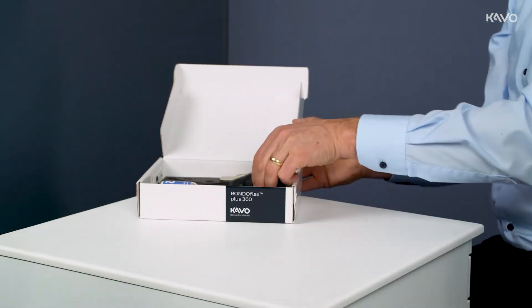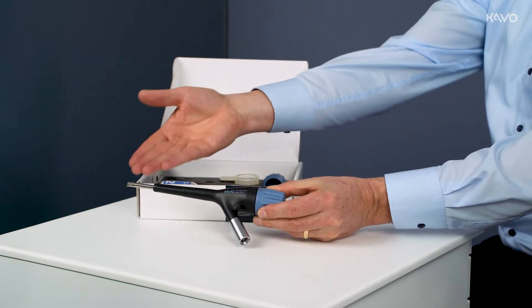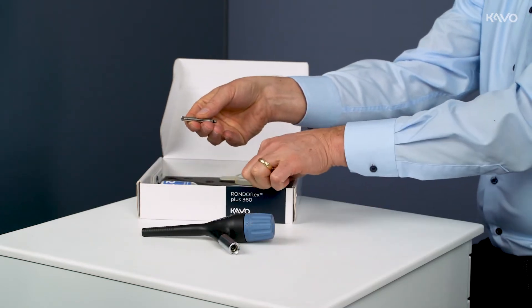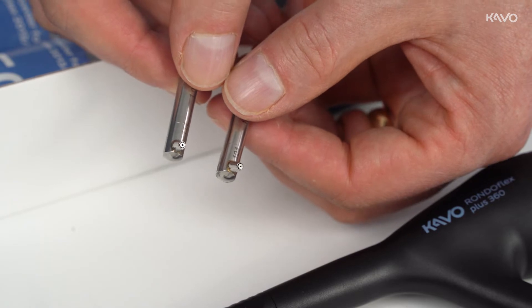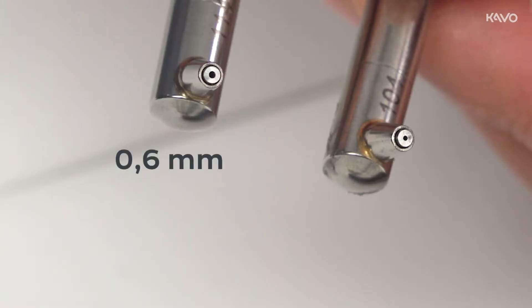The RONDOFLEX PLUS 360 consists of a base body, a canular, and a powder container. There are two different canulars with different diameters, both included in the scope of delivery. The canular with a 0.6 mm diameter exit port is used for flat preparations, while the canular with a diameter of 0.46 mm is used for selective deeper preparations.